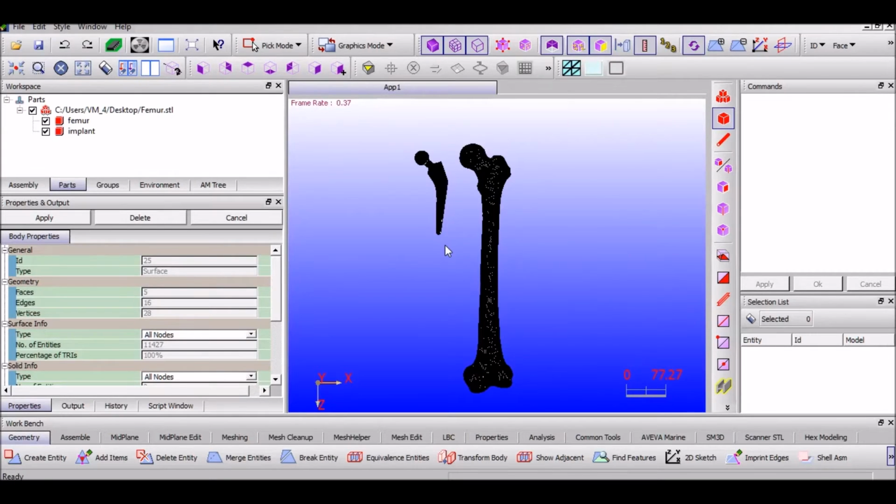Today I am going to be demonstrating how to create an FE model of a femur and its implant using TSV Pre software. Here we already have the models of the implant and the femur. So the next step is to translate the implant such that it is fitted into the femur.